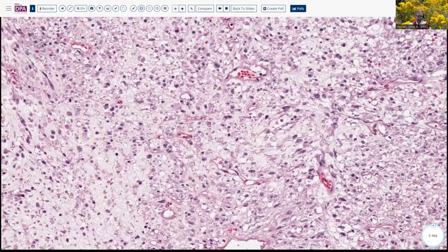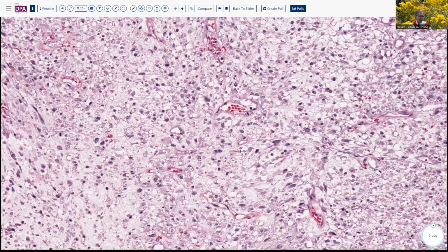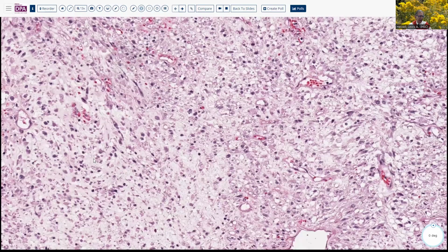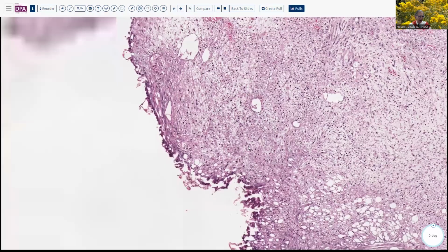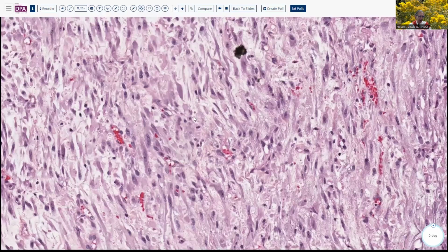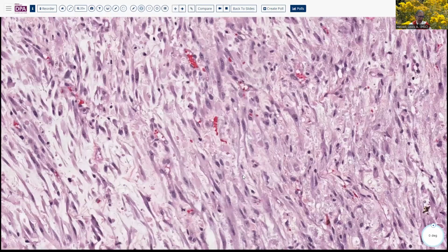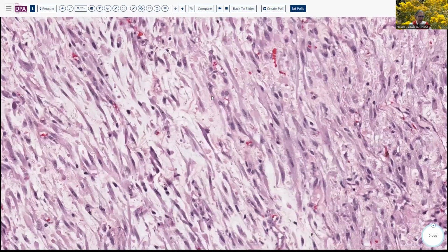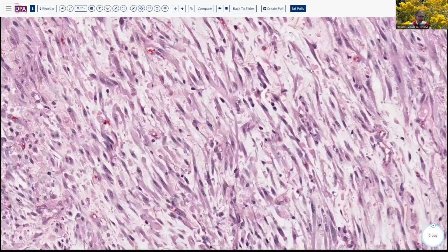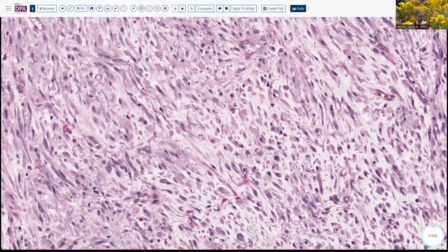So this shows you a mixture of edematous cells, some variable sized nuclei, a few larger nuclei here. And you see this process has some areas of more spindle-shaped cells and really quite open nuclei, spindle-shaped proliferation here. But interspersed then are these mast cells, a few plasma cells, and so forth.